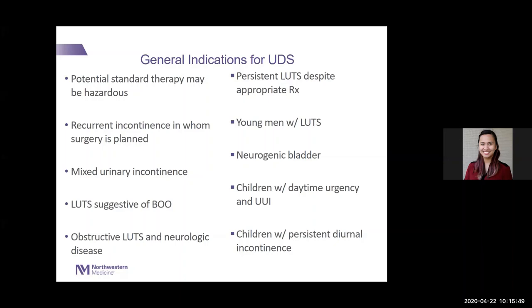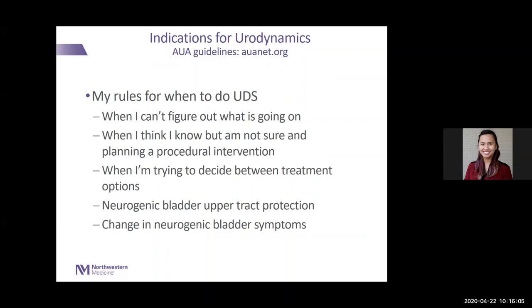This is kind of general categories. I'm not going to talk about pediatric urodynamics because there's too much math and calculation involved, but I'm just kidding. But these are kind of the general indications of when you'd want to do urodynamics. If it's going to help you make a decision, then it makes sense to do that for the patient.